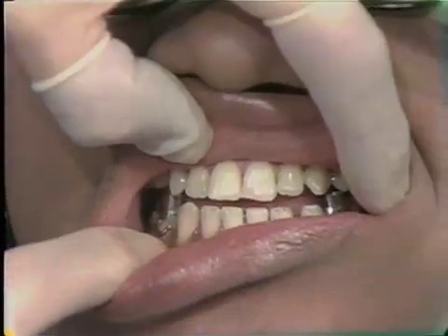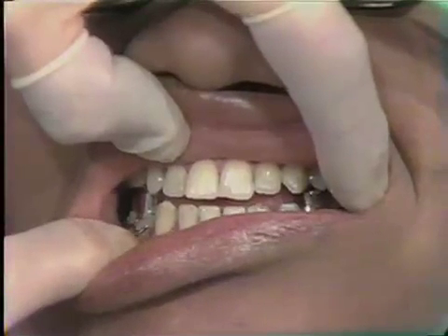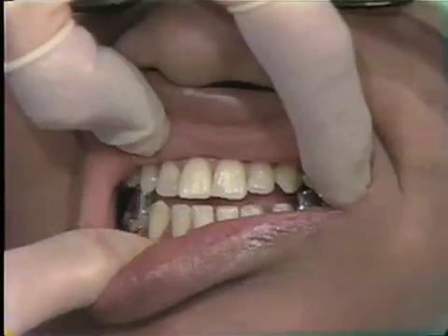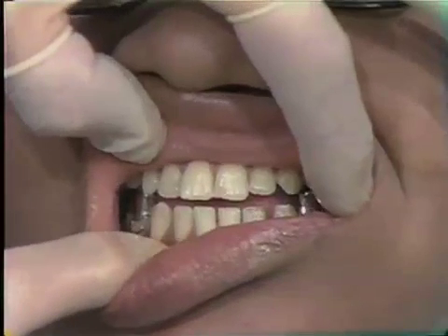This appliance was made for the patient because of temporomandibular joint problems, and with the use of the appliance, they have disappeared.